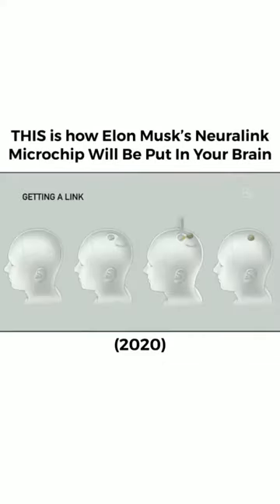So in terms of getting a Link, like I said, essentially you open a piece of skull, you remove about a coin-sized piece of skull, and then the robot inserts the electrodes. We'll talk more about that later. Then the device replaces the portion of skull that was removed, and we basically close that up with actually super glue, which is how a lot of wounds are closed, and then you can just walk around right afterwards. It's pretty cool.